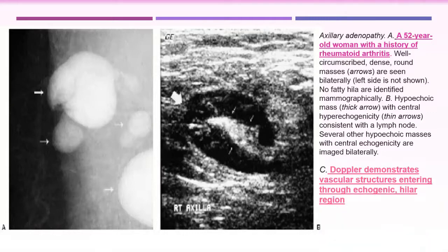and the lesion edema. And on Doppler here it is not shown. Also, you can differentiate. We have seen the example of necrosis high up with reactive lymph node, though the cortex was diffusely thickened, the hilum central only. The Doppler demonstrates the normal distribution, even if the vascularity is increased, but having the normal distribution through the central hilar region.